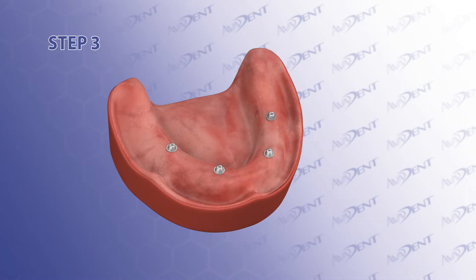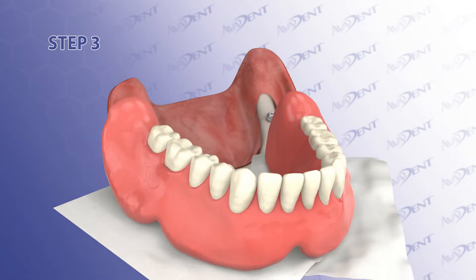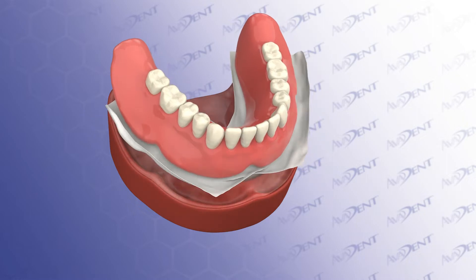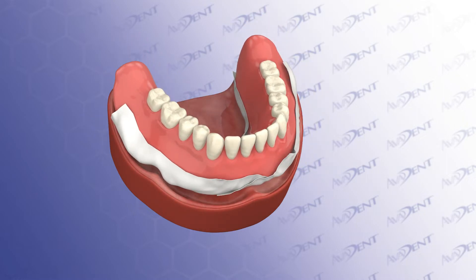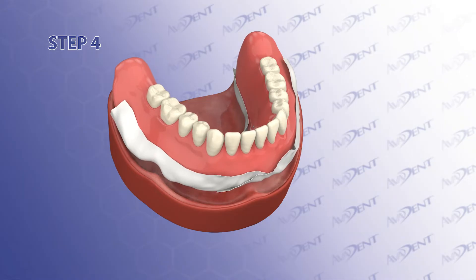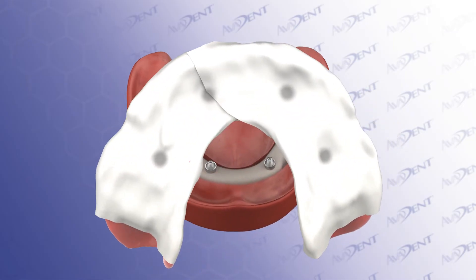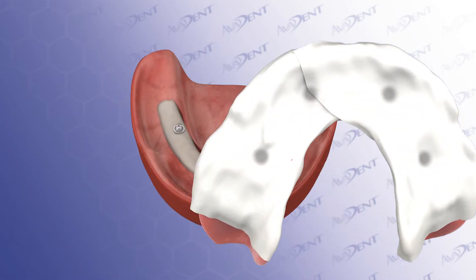Step 3. Seat the denture over the multi-unit abutments, guide the patient into occlusion with the mandibular jaw in centric relation, and then remove the denture. Step 4. The PTFE tape allows for removal of the denture before the bite registration material sets up, so quickly remove the denture and set it to the side.